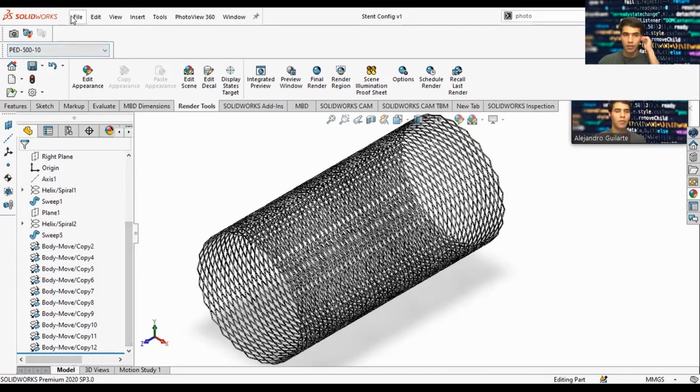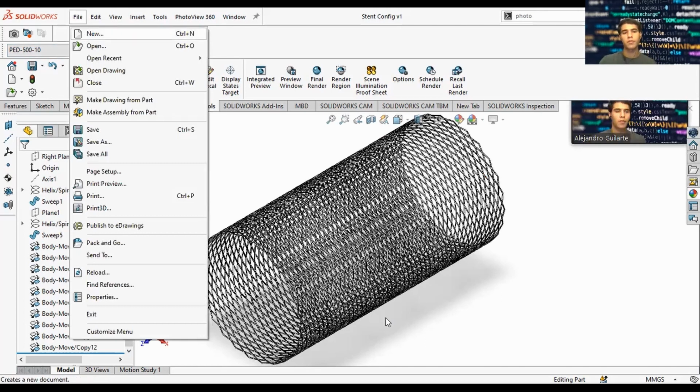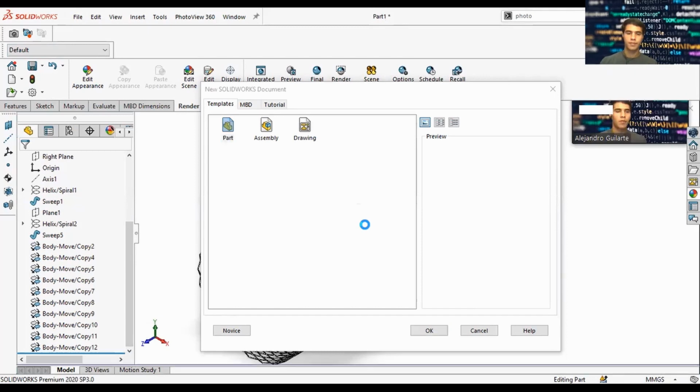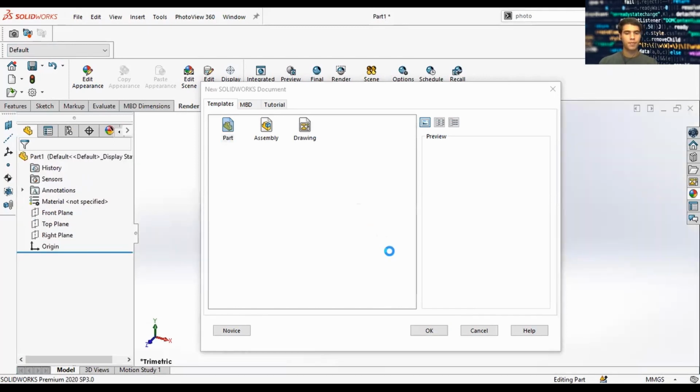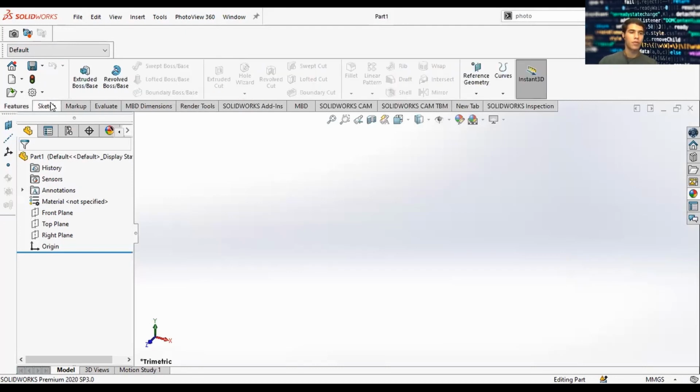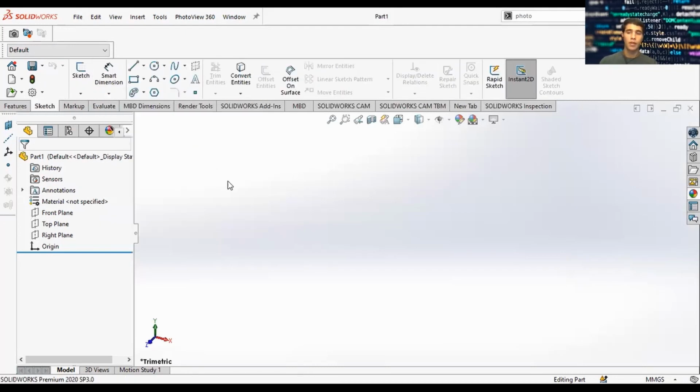First thing we're going to do is make a new part. So here we are with a new part. We're going to go to features. If you want to, you can follow along as well. But since we're pressed for time, I'll be finishing this as soon as possible, and we'll take questions towards the end.